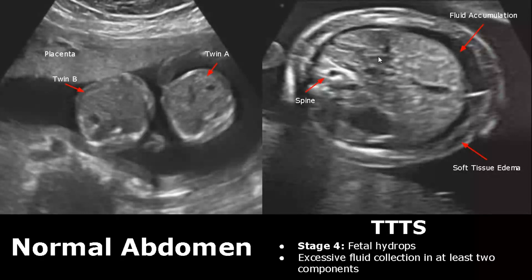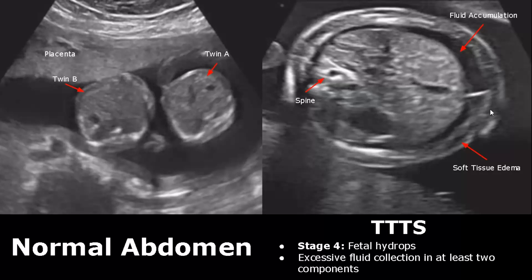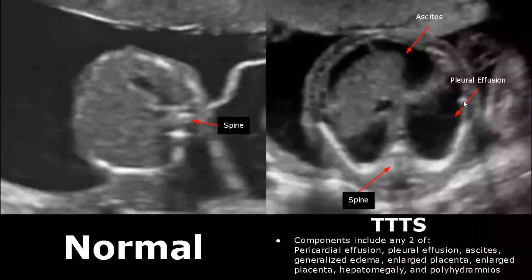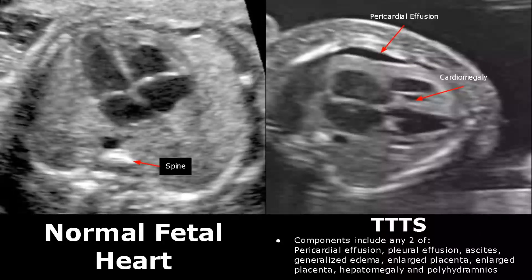Fetal hydrops is the fourth stage of twin-to-twin transfusion syndrome. Excessive fluid collection will be found in at least two components, including pericardial effusion, pleural effusion, ascites, generalized edema, enlarged placenta, hepatomegaly, and polyhydramnios. Skin edema causes skin thickening. Here we see ascites and soft tissue edema, as well as pleural effusion. It usually occurs in the recipient twin. Here we also have pericardial effusion and cardiomegaly — an enlarged heart with accumulation of pericardial fluid.